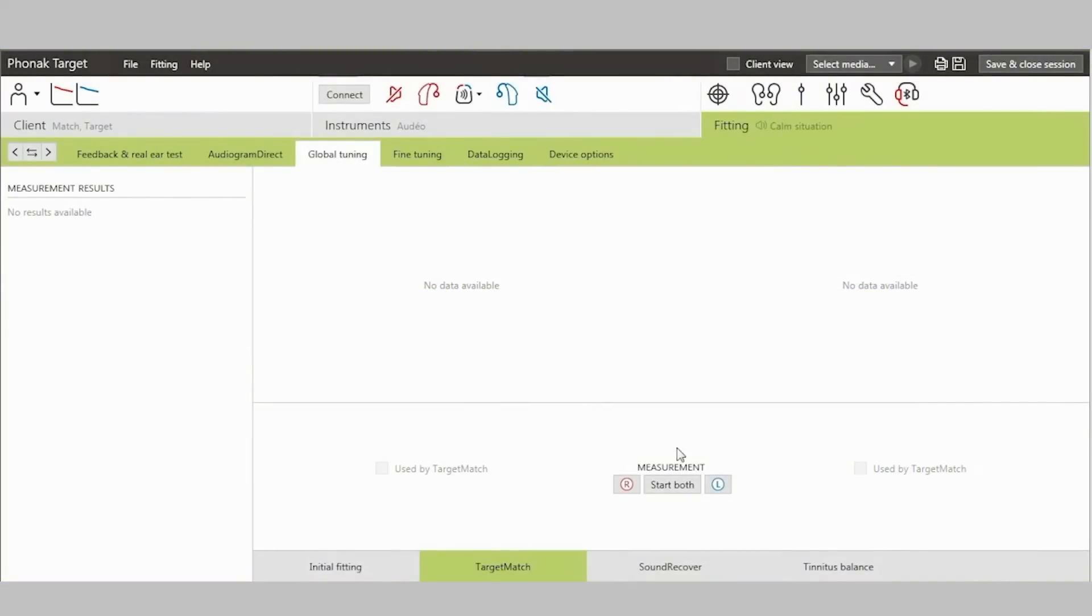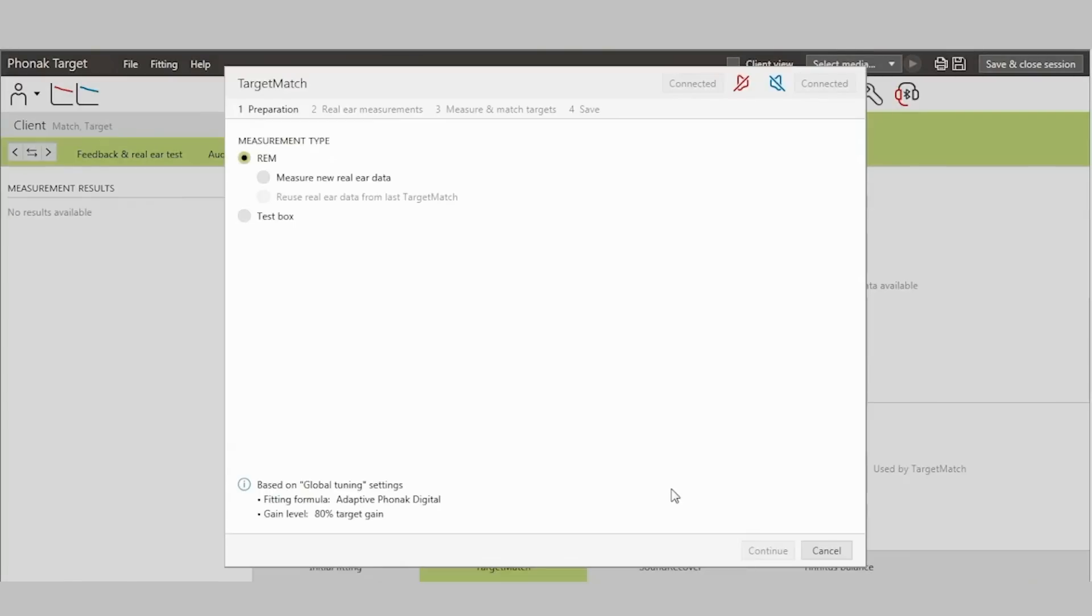Let's take a look at how Target Match works in Phonak Target. First, go to the Global Tuning tab. Target Match is visible and you can start measurements. Now, select whether you want to perform real ear or test box measurements.